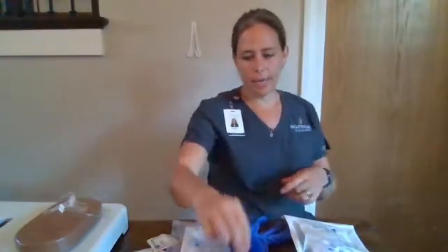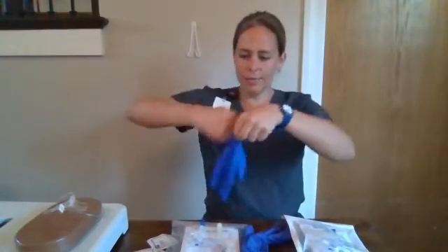Hi, I'm Kimberly Treon, and I'm going to demonstrate IV fluid and medication administration. I'm going to start with hand hygiene and gloves.